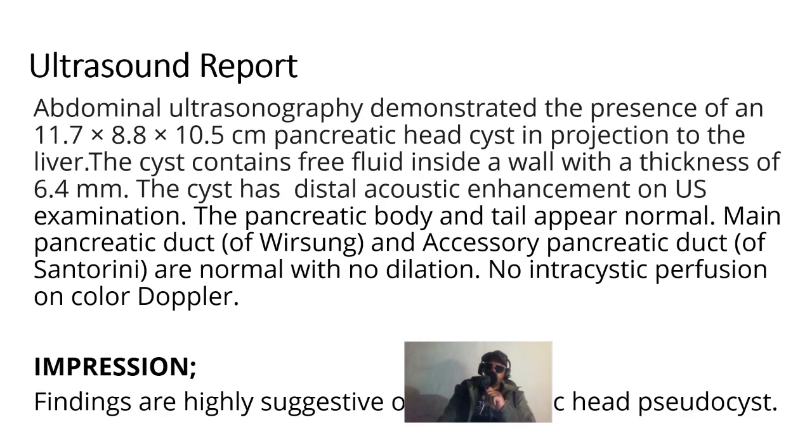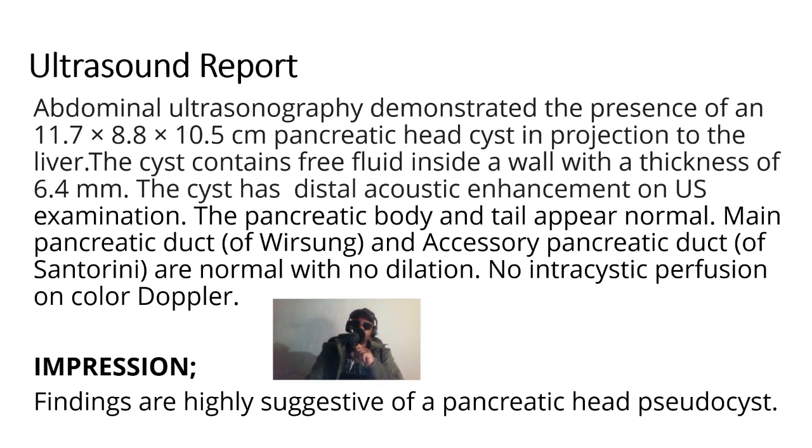It's very pertinent that you know how to report on anything that you come across. It doesn't carry any meaning when you see something on ultrasound and you are not in a position to report it, because you can create non-existent pathologies, or you can miss critical pathologies that can be life-threatening to a patient. So I feel that we must make an effort to upscale our report writing skills and become competent enough in writing reports that carry meaning to the referring clinician. At times too much jargon might not be necessary in your report because it might not give any meaning to the referring clinician. Your language must be understood by the referring clinician so that they know exactly what you're trying to communicate. I believe this is making sense.